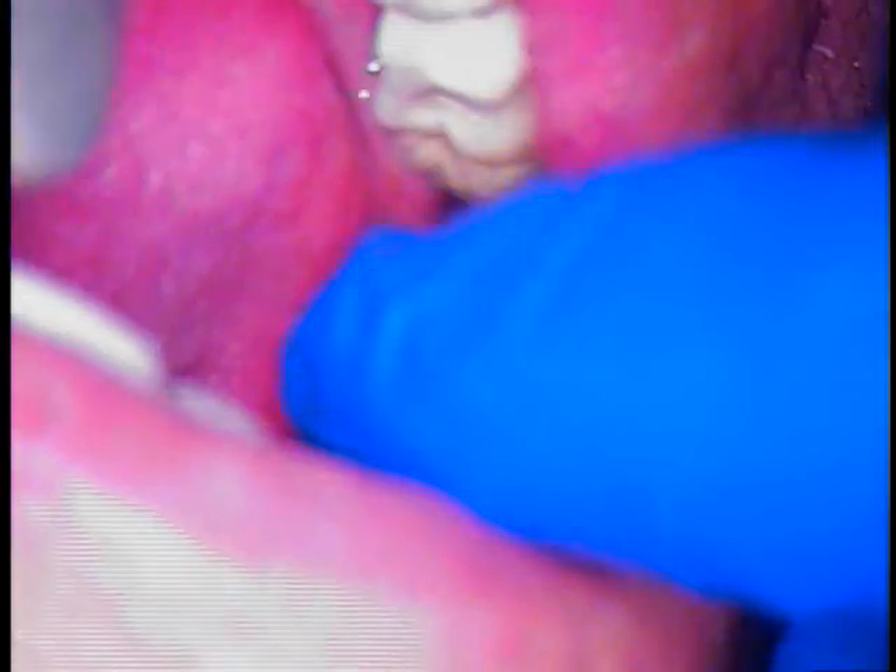I've got to pick out a healing abutment. Now I'm looking internally — I see some filings inside. Since this is a Strauman, I'm trying to see if there's been any changes occurring on the threads. The threads look really good and pristine. So we'll pre-soak again. We'll do a micro suction out first, then do it again. Always small then large.